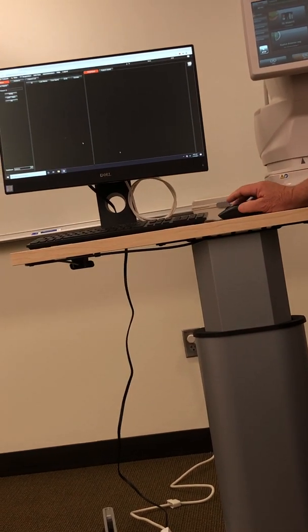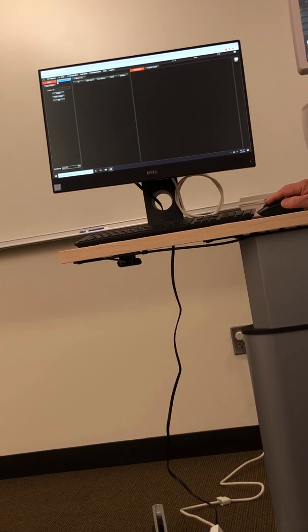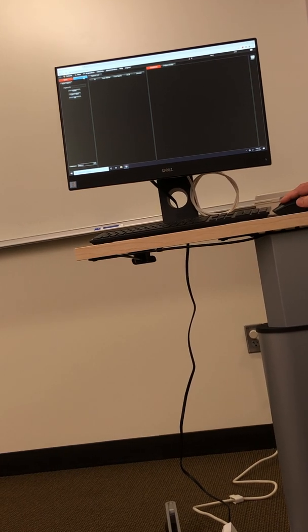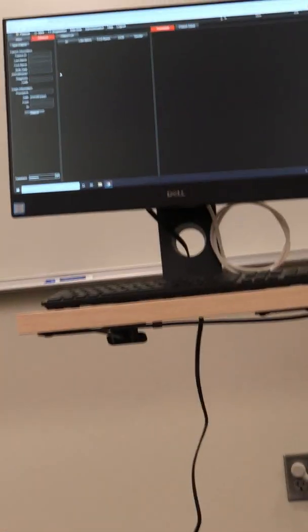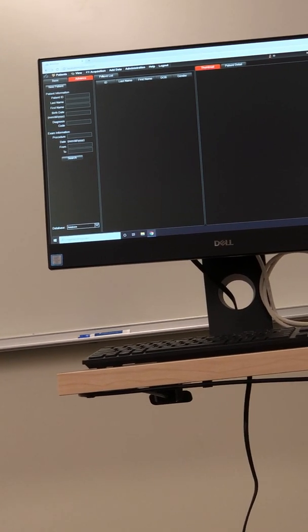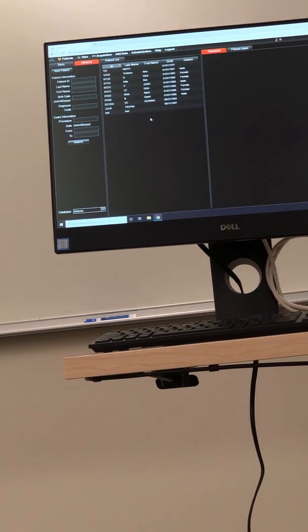This is the opening screen. This is basic information here. Advanced, you can have more data to search a patient by. Or you can do patient list, so you search, and it's going to show all the patients.